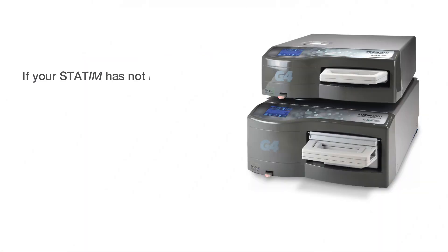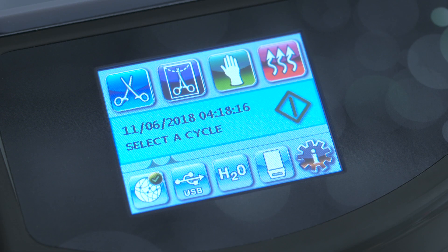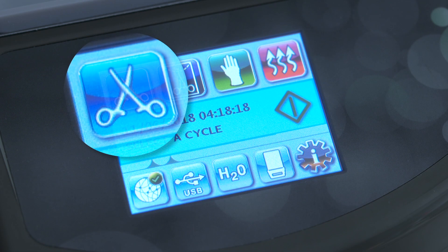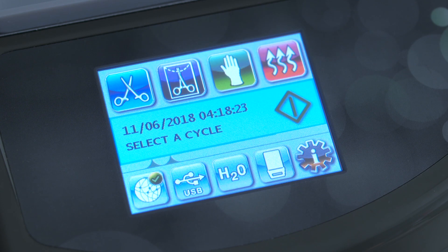The STATIM must be in this leveling position to drain properly and enhance the drying efficacy. If your STATIM has not been connected to the G4 network, please follow the steps in the power-up wizard to connect your machine and complete the online registration. The STATIM offers three cycles — unwrapped, wrapped, and rubber and plastics unwrapped cycles — which are found on the top row of the LCD screen.